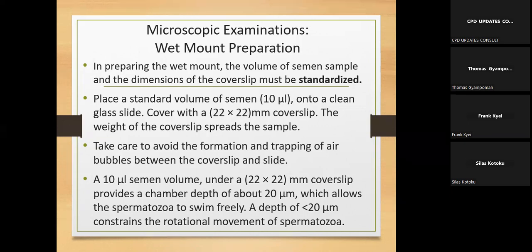Millimeters because the numerator is 10 millimeter cube and the denominator is going to be 484 millimeter square. So the 0.02 that we get, its unit is going to be what? Millimeters. So you are going to get 0.02 millimeters.